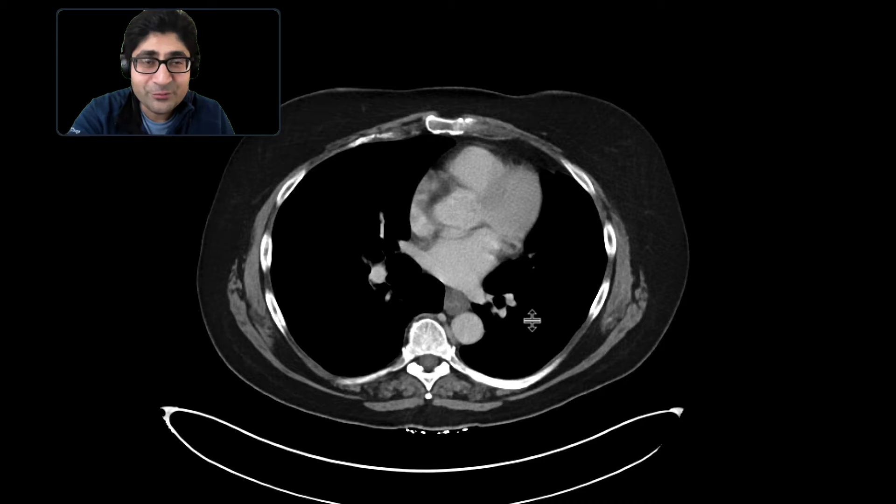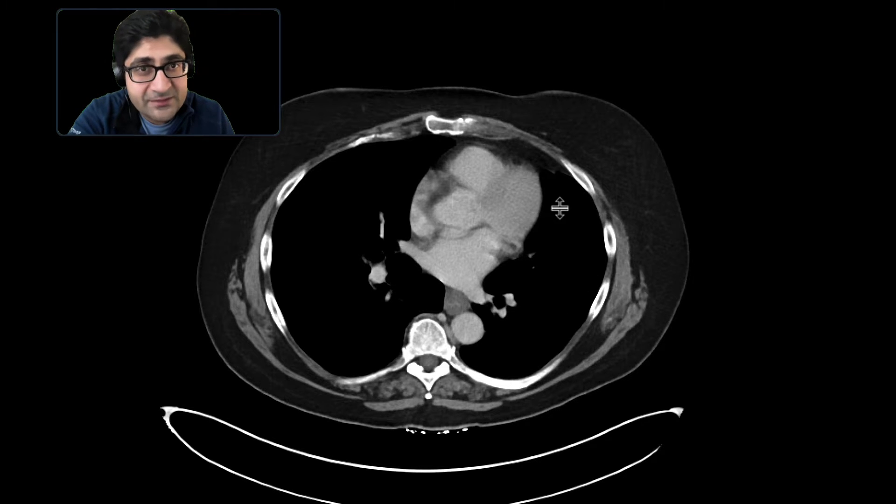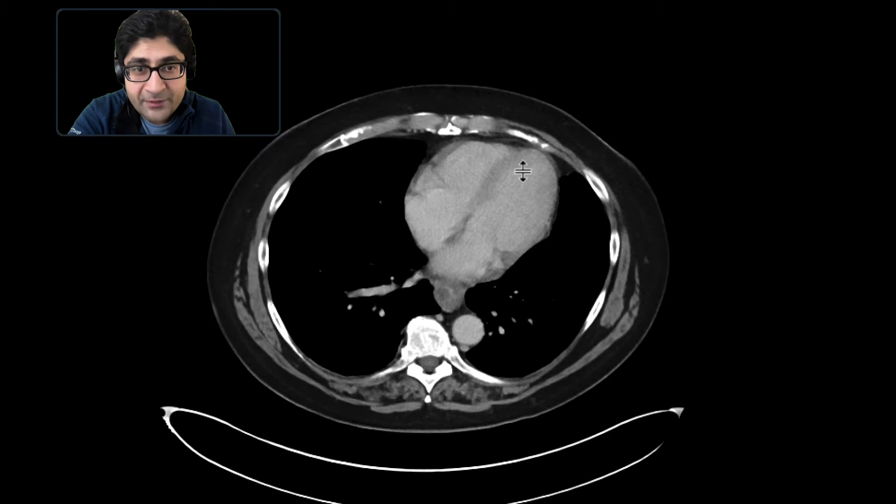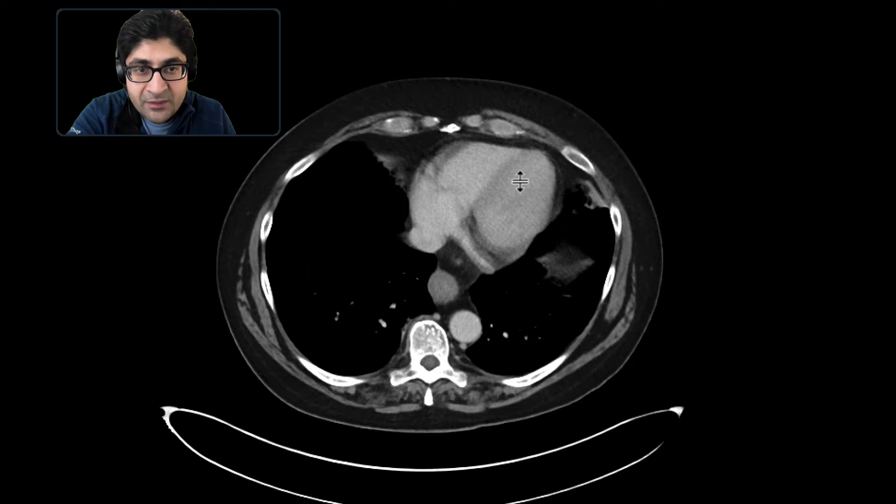This is a patient who presents with abdominal pain, nausea, and vomiting. A CT scan was obtained to further evaluate this.